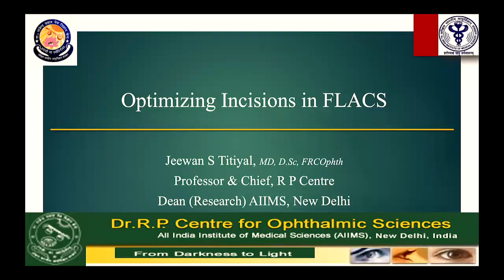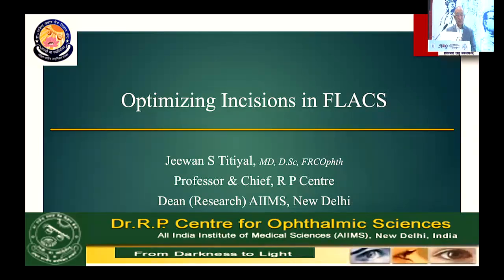Just what we are talking about, doing a capsulotomy in white cataracts. I think one of the first studies we did was in white cataract only. We compared the femtosecond laser-assisted capsulotomy versus the manual capsulorhexis, and subsequently the incidence of a capsule giving way in these cases. And we realized femtosecond was equally as strong as the manual surgeries. The only difference we found was the circularity index was better with the femtosecond-created capsulotomies. And the incidence of radial tear was almost similar in both categories. Though we did have a little bit of incomplete capsulotomy in femtosecond, those could be managed very easily also.